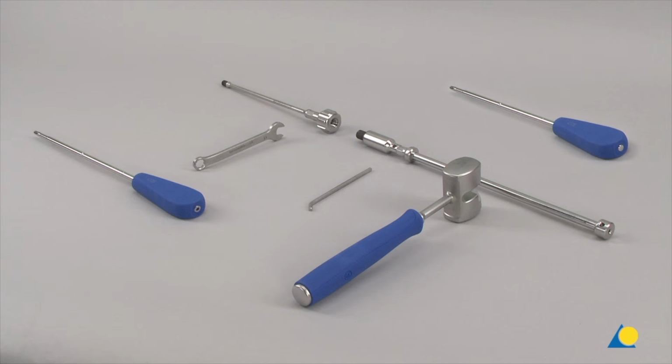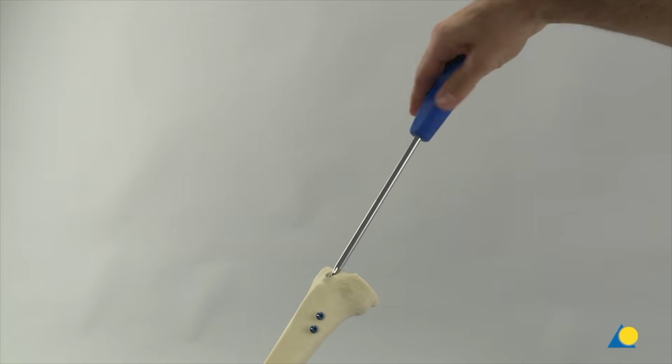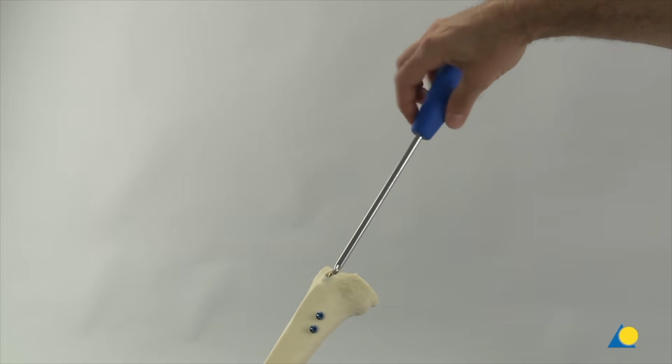The instruments needed include the screwdriver, star drive T40 with spherical head, cannulated, length 330 mm. The extraction screw for tibial and femoral nails, the combination wrench 11 mm diameter, the hammer guide, the pin wrench 4.5 mm diameter, the screwdriver star drive T25 self-holding, length 330 mm, and the combined hammer. The T40 star drive screwdriver is threaded into the end cap, and the end cap is removed with counterclockwise turns.